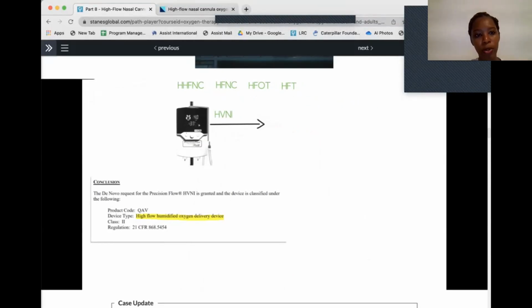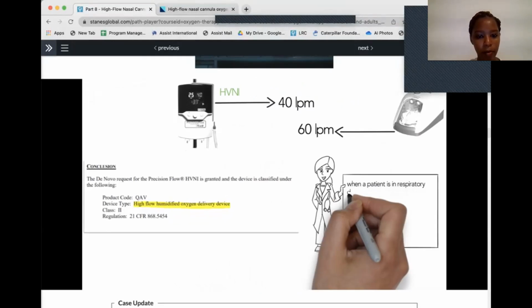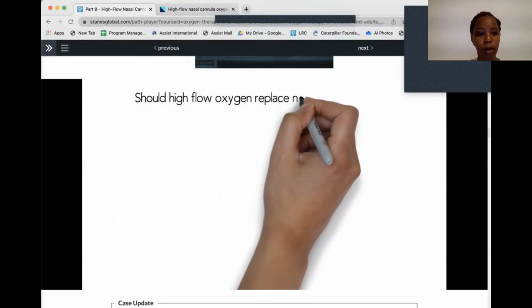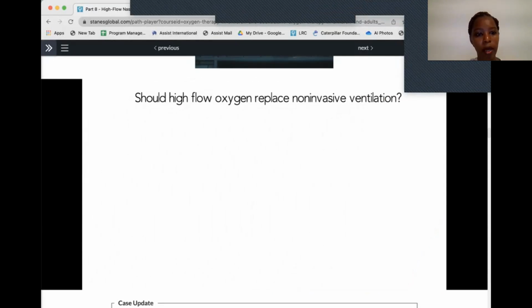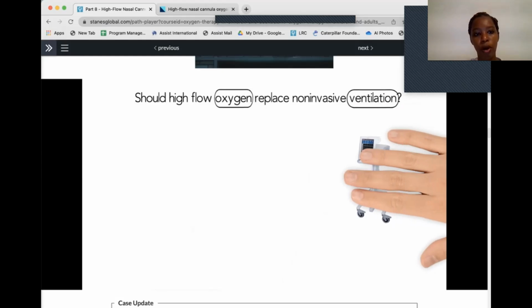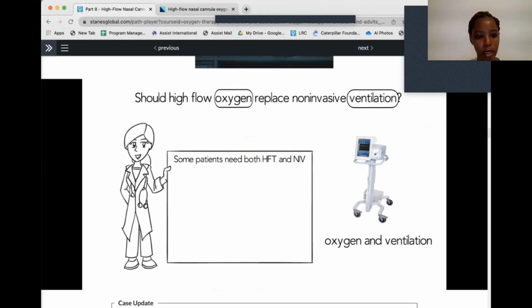And as you put it in, you're supposed to put in a tight fit on the patient. So there's a way you adjust at the back so that it can give a proper tight fit to the patient. And then you're able to titrate even the flow of the oxygen and the FiO2, depending on how the patient is responding. You can start initially, give it some time, and then see if you need to increase. And even if the demand for the patient is adequate, you'll be able to see it from your parameters. Then you'll be able to either decrease or increase the settings. So you'll be able to see that in the video.